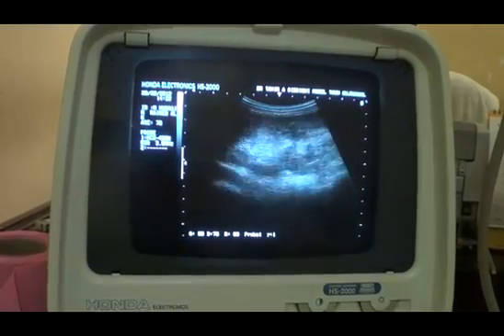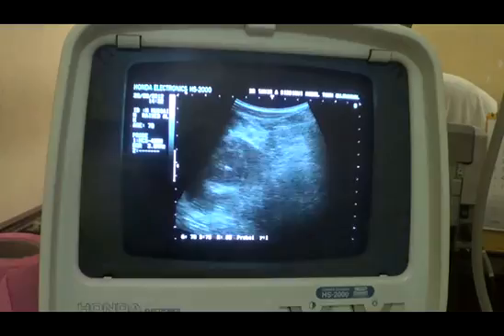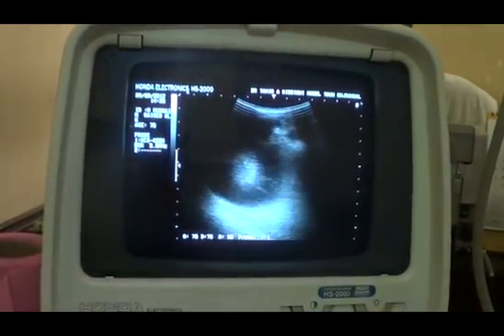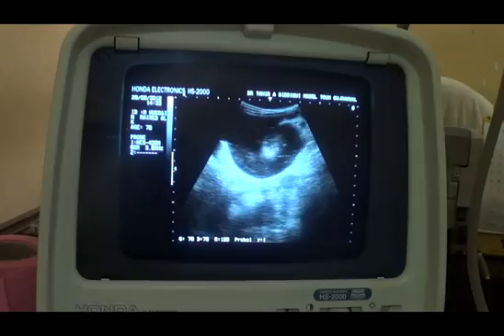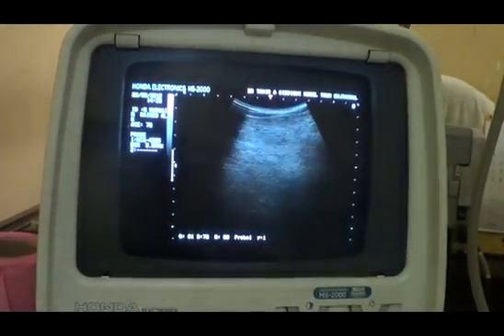Okay, let's see if there is any abdominal pathology, bowel related pathology or not. We give a sweep in all of the abdominal quadrants to rule out any evidence of some bowel related pathology.